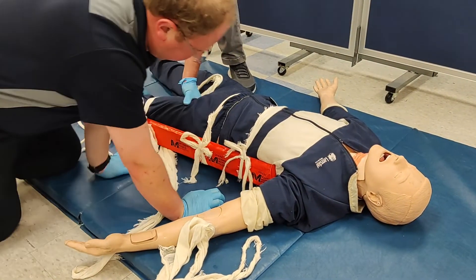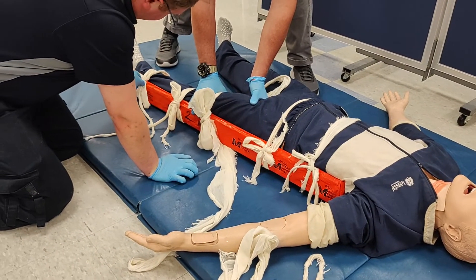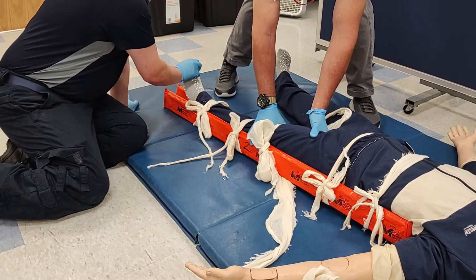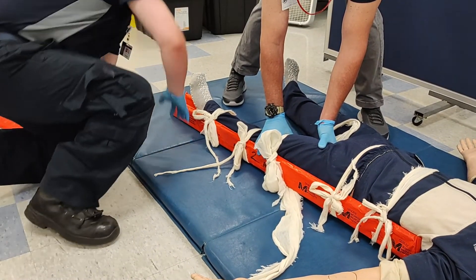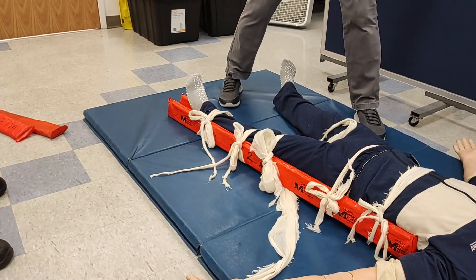Once complete, check and adjust any cravats as needed, paying especially close attention to the original ones to ensure they haven't loosened over time. Check PMS — if the splint is too tight, you can loosen the straps; otherwise, you can transport the patient.